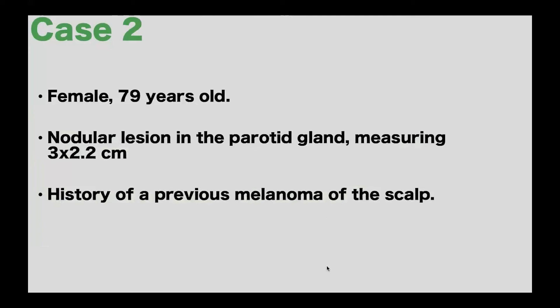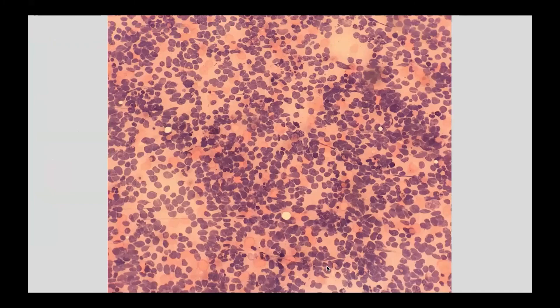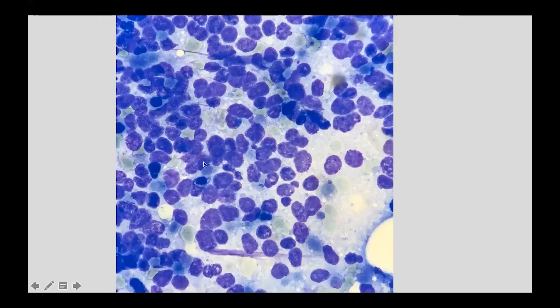Our second case is a 79-year-old female who presented with a nodular lesion in the parotid gland measuring 3.4 x 2.2 centimeters. She had a history of a previous melanoma of the scalp. We performed the FNA of the parotid gland, and on the Pap smear we could see a large population of cells that looked somewhat atypical but kind of monomorphic in appearance — scattered, some isolated, some in discohesive groups, with some molding between cells. On Diff-Quik, nuclear chromatin was somewhat irregular with a molding artifact and a necrotic background.